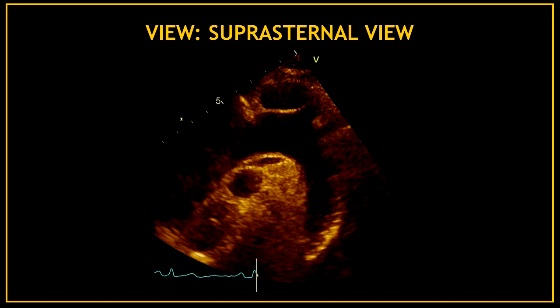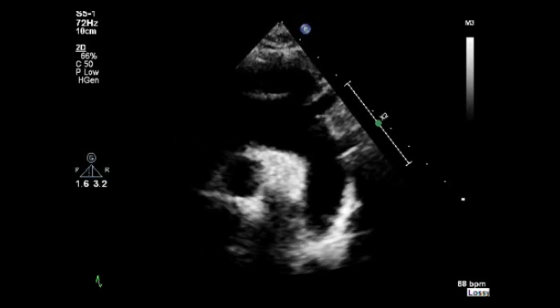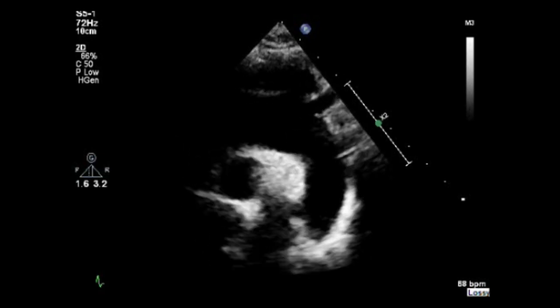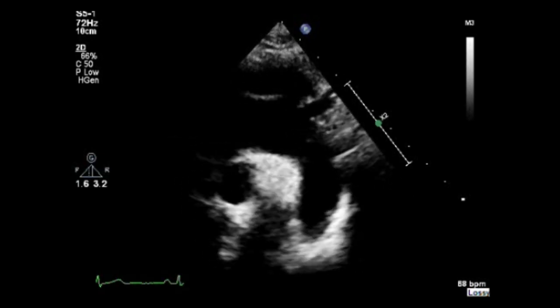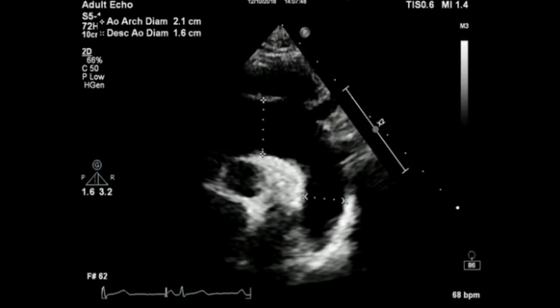Now I'm going to show you on video, one by one, all the measurements you need to obtain when you are in the suprasternal view. Obtain your suprasternal view and perform a visual assessment of the ascending aorta, aortic arch, descending aorta, and aortic arch branches. Then proceed to perform a size assessment and measure the aortic arch diameter and descending aorta diameter. This can be done by 2D.